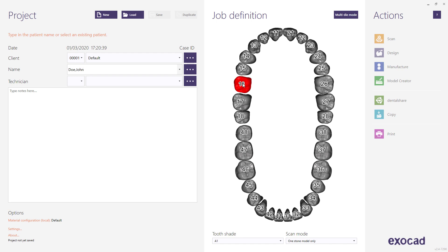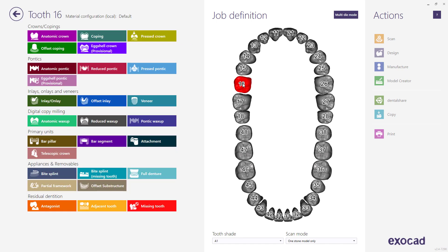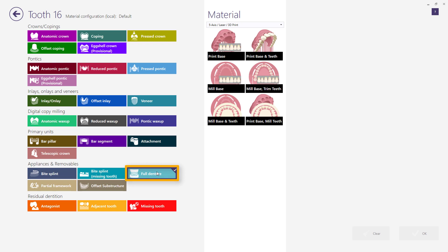Click on the numbered tooth you want to design. Select FullDenture as the restoration type. Then choose the desired material based on the manufacturing technology you wish to use, milling or printing.